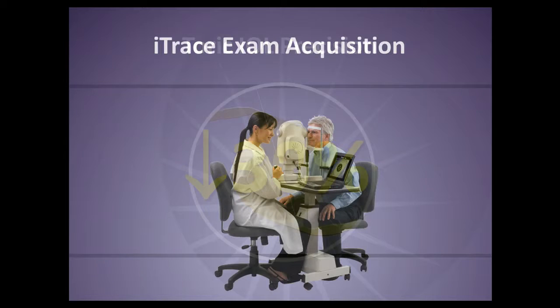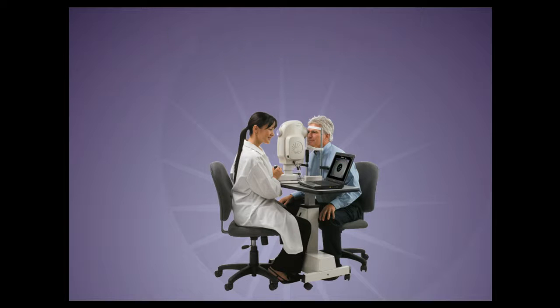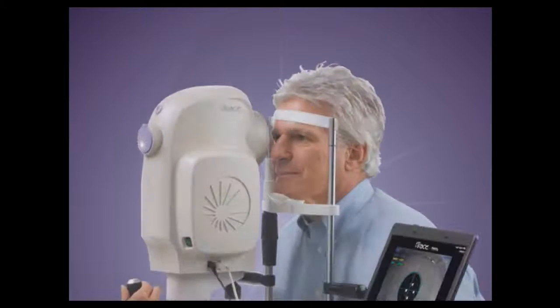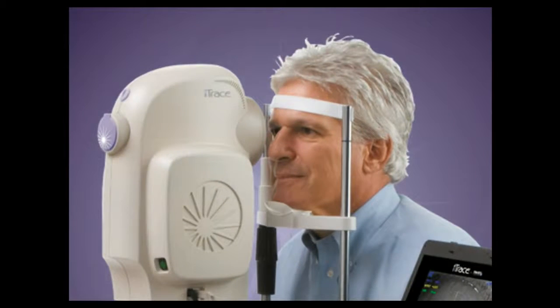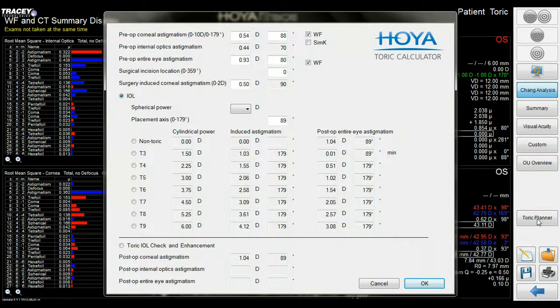While doing the pre-surgical workup, we have placed our aligning marks at 0 and 180 degrees at the slit lamp, using a method that will be visible for surgery. The patient is then measured with the iTrace. With the Chang analysis and the angle kappa and angle alpha display, we have determined that our patient has a cornea clear of higher order aberrations, and the patient has a small angle alpha and is a good candidate for a Toric IOL. We move to the Toric Planner module and we're presented with a HOYA Toric calculator input screen. Here we enter the pre-surgical data.